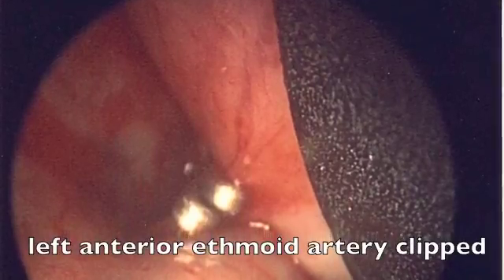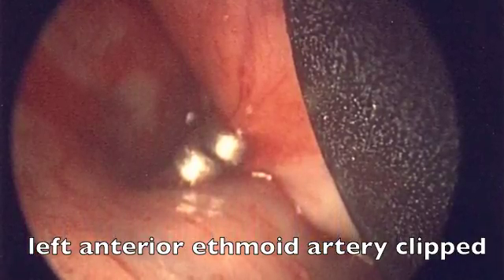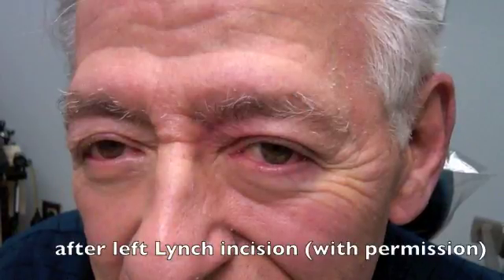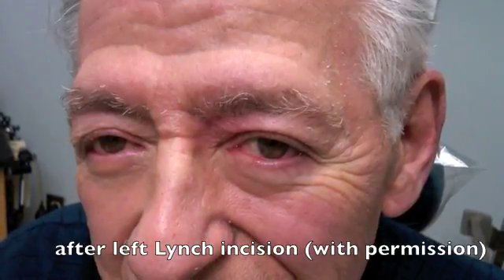Here's a view on the left side of clips being in place on the anterior ethmoid artery through a Lynch incision, which is on the medial aspect of the patient's orbit. A Lynch incision tends to heal very well, as seen in this patient four months after his left Lynch incision for severe epistaxis.